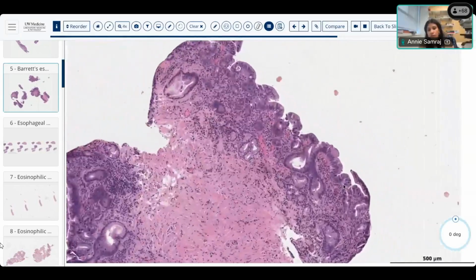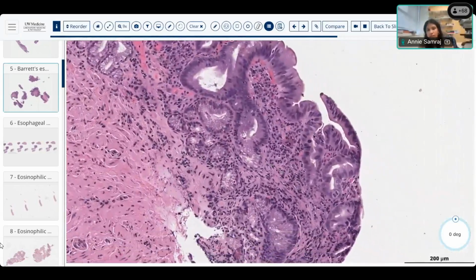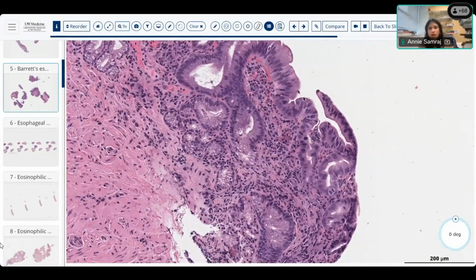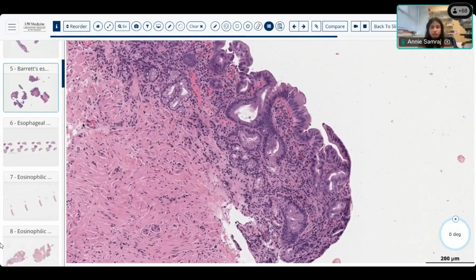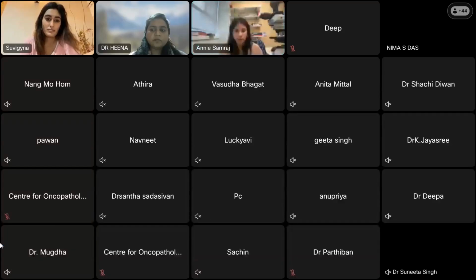So you can use the lines. Here, for example, you don't have line 1, you don't have line 2, and for line 3, you can see the nuclei make a jagged line. So you can use the 4 lines to help distinguish between dysplasia and reactive conditions. And then sometimes it's simply not possible.